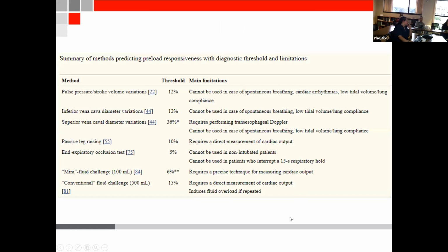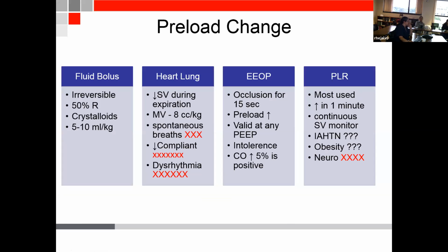Do you mind if I ask you a question? We're trying to do it a lot, but sometimes we don't have an arterial line, so we're using the cuff. Yeah. But what would you look at, the difference in the MAP, or what would you use? Systolic blood pressure, because I showed you. Yes. The systolic arterial pressure variability correlates well with that. And should we use the 10% that we talked about, I think it's between 10 and 13? It's not 18, I think.